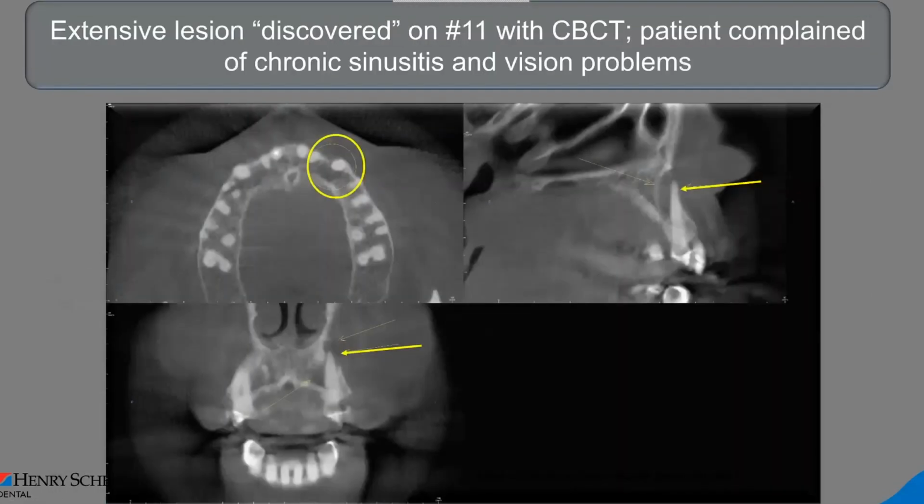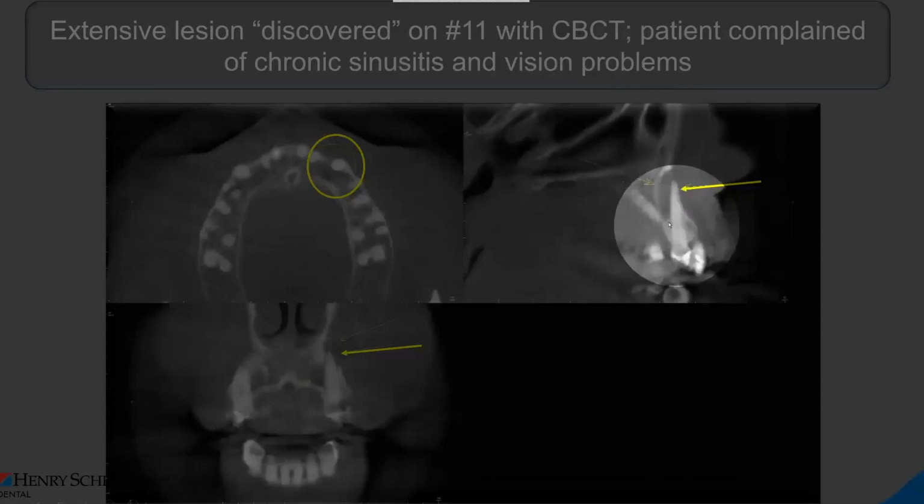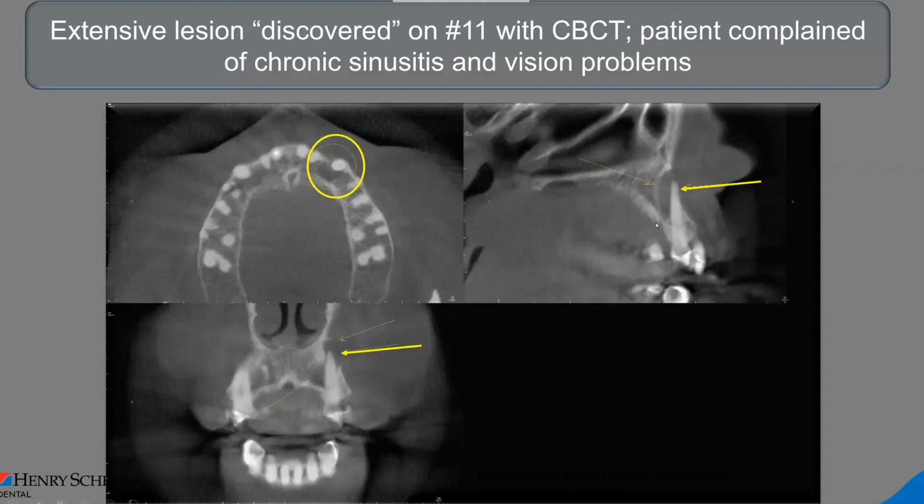This was another case. This was sent in by a dental office, and really quite a phenomenal case. The patient didn't even know that she had this going on. This was actually the dentist's wife. She happened to just hop into the machine when they were taking the images. They were first setting up the cone beam CT, and she didn't even know that she had this happening.